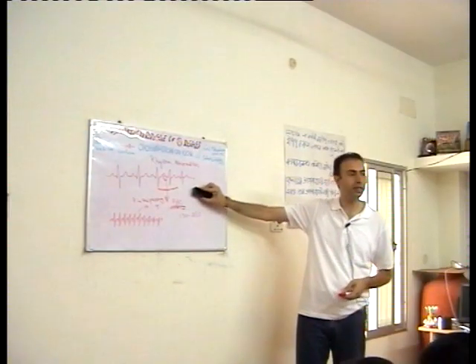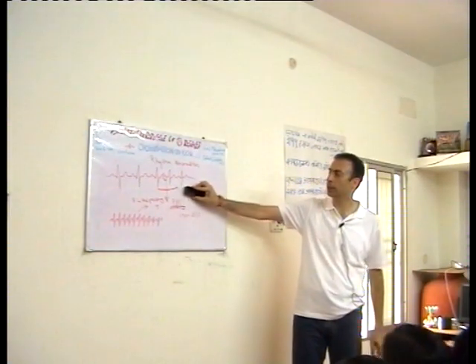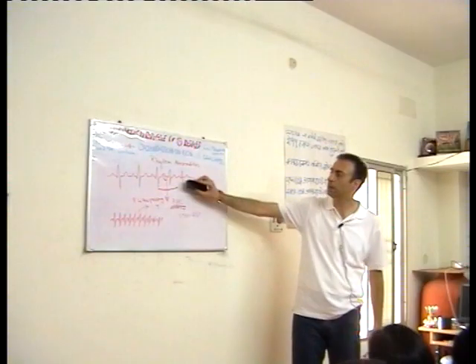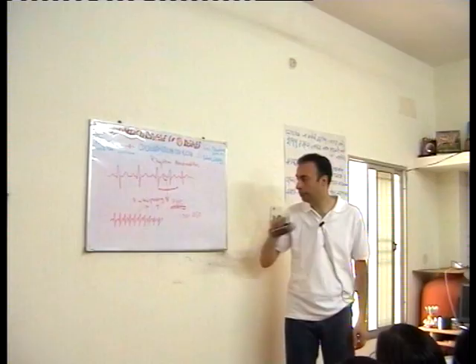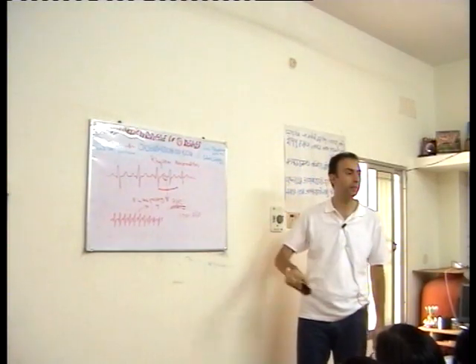The shape has somehow changed. P and T have become one because of the very high rate.